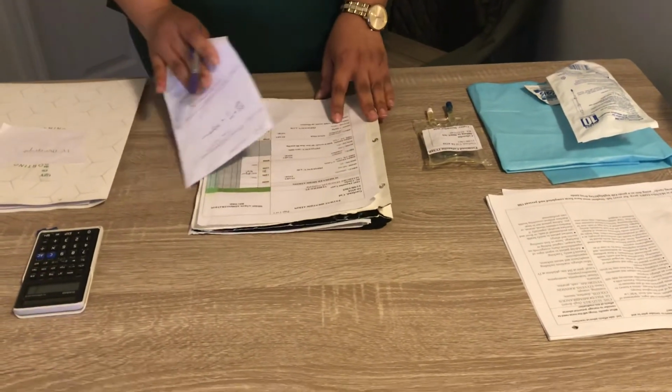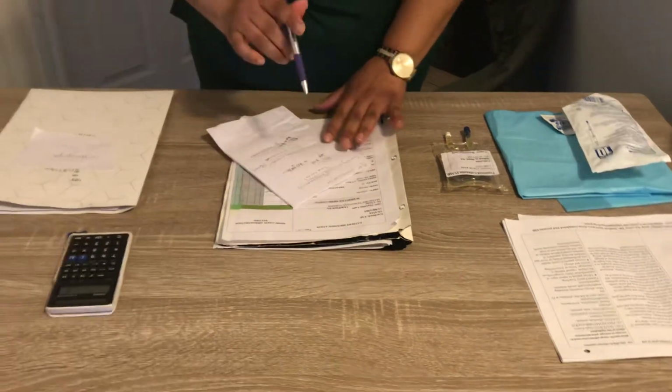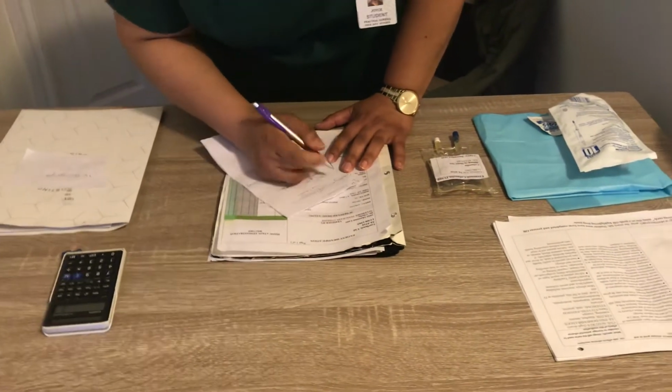So after my second check, I'm going to do my calculation. And first of all, I'm going to calculate by gravity.